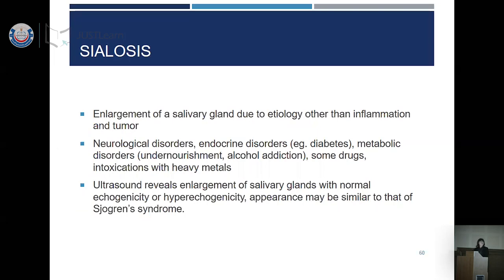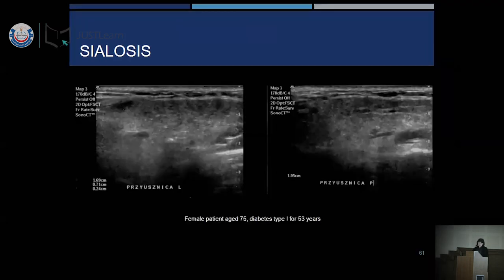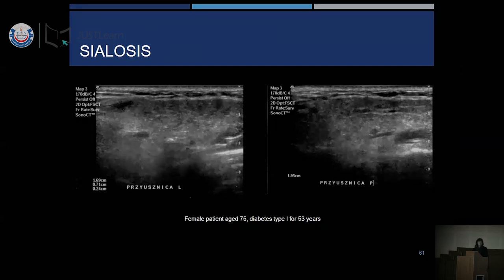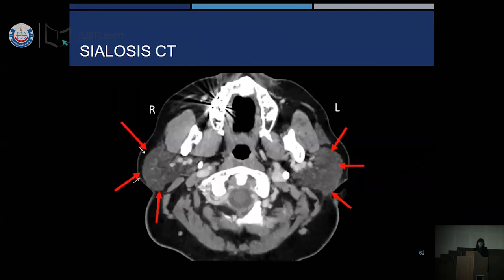Sialosis is any enlargement of the salivary gland not due to inflammation. It can be caused by neurological diseases or long-course diabetes. A female patient aged 75 with type 1 diabetes for over 50 years presented with signs of sialosis on ultrasound. Medical CT also showed bilateral enlargement of parotid glands with decreased density — well-limited and non-homogeneous lesions.